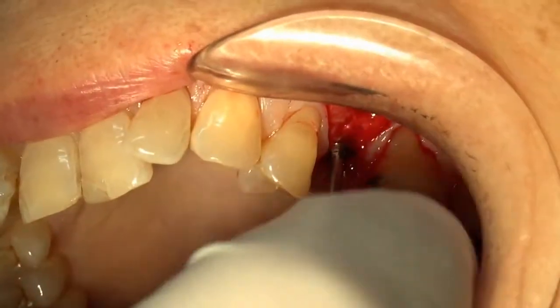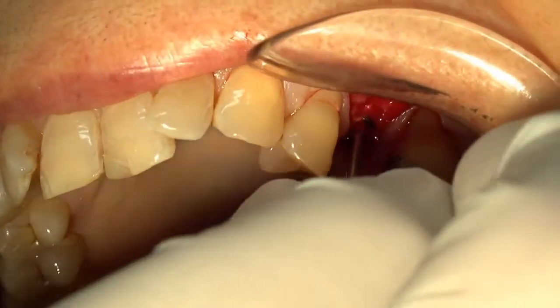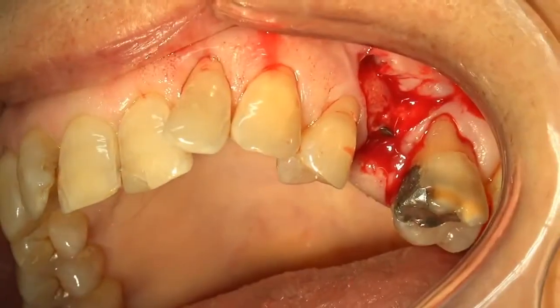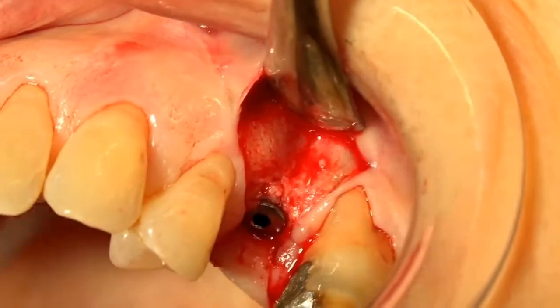So again, remember, 3D Bond cannot be used in larger defects, only in socket grafting with or without buccal plate from first central until second premolar, or molar with a septum.